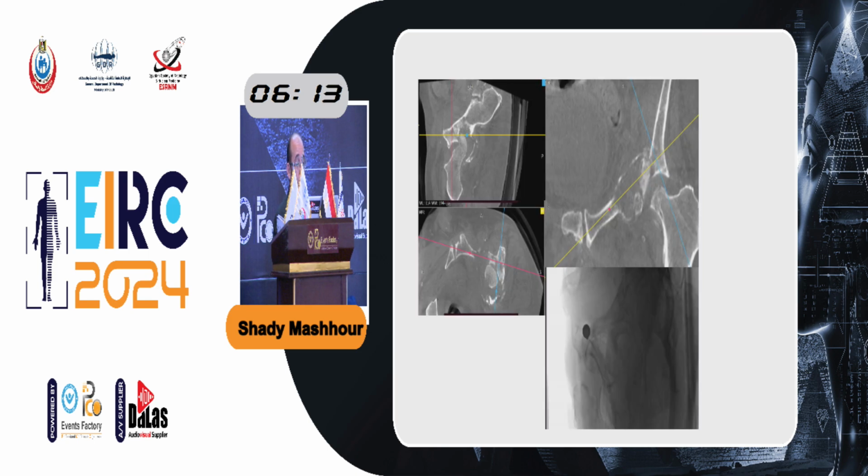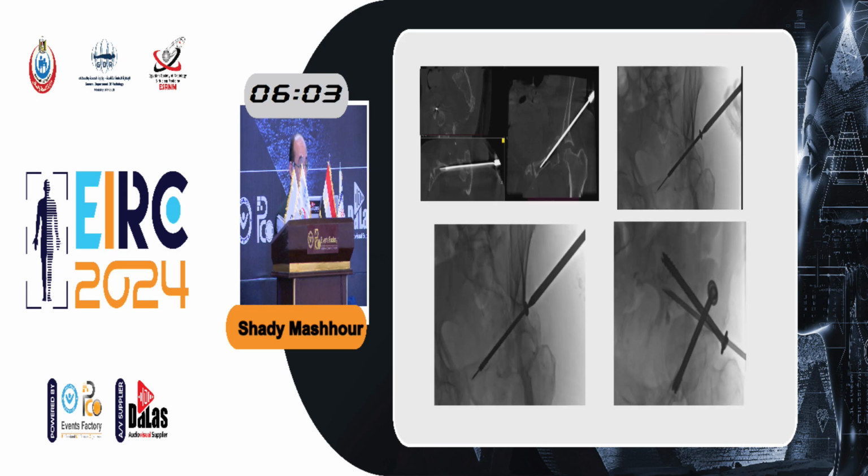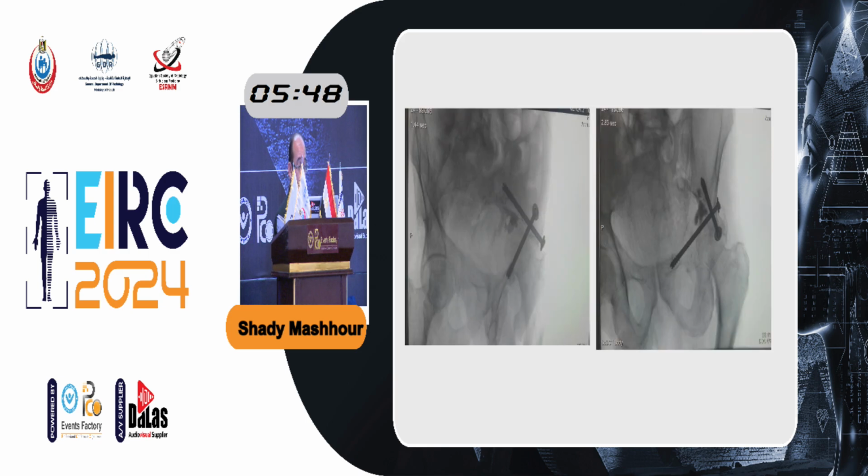So using the cone beam CT, we do a CT on the table. We plan the areas perpendicular to the fracture. We put our markers and go to the needle in a bull's-eye position or using needle guidance and place our screws along the tracks through very small holes. Again, we threaded the screw in the iliopubic and the supraacetabular region and then injected some cement to stabilize the screws. This is the final result, which was fair to the patient.